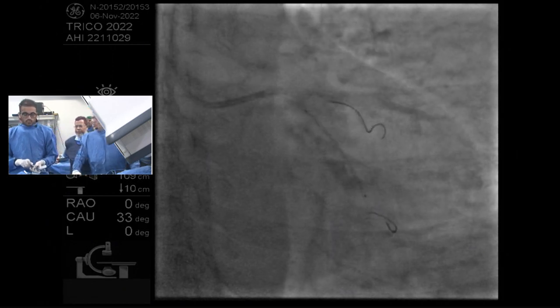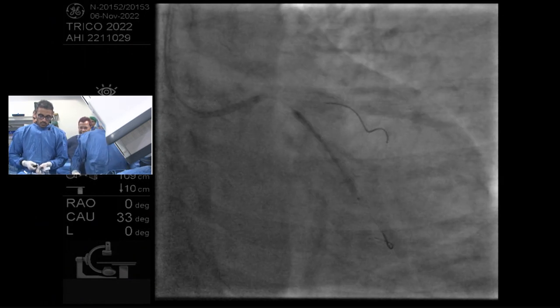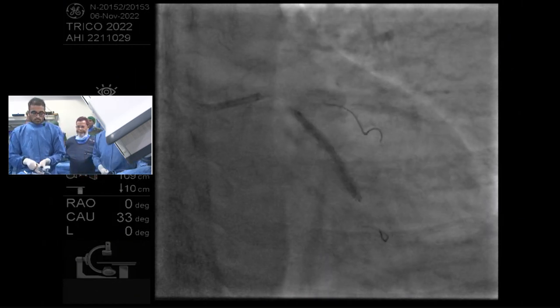Take it up. Go up. Go. 12. Good. And then let's open a 2515 NC balloon and a 3015 NC balloon, please.